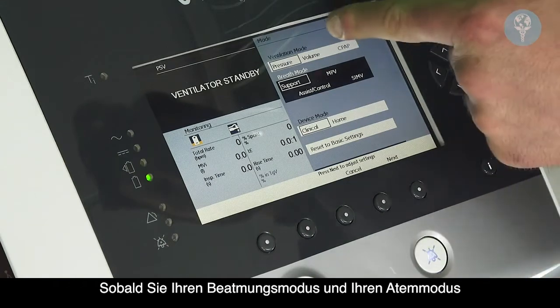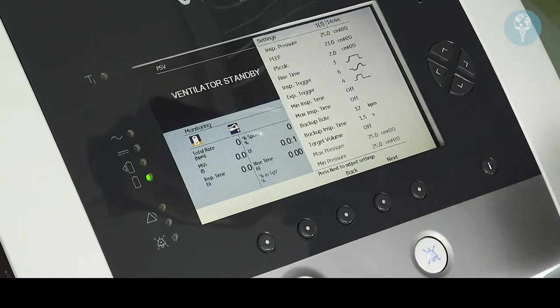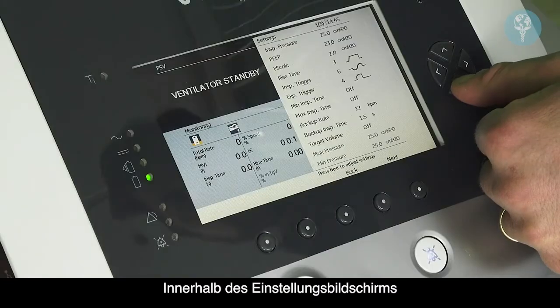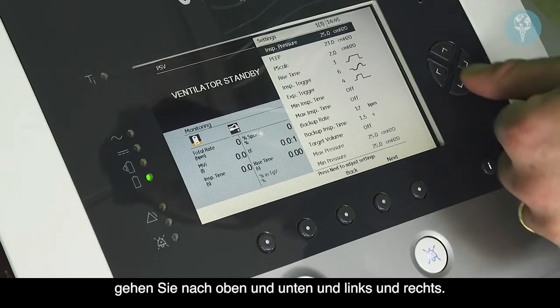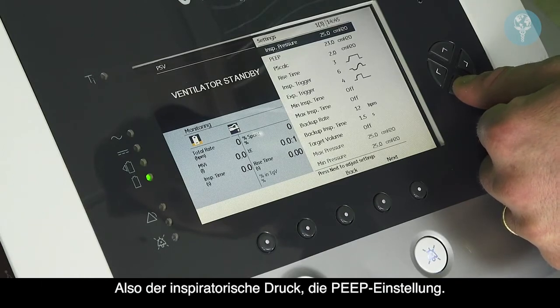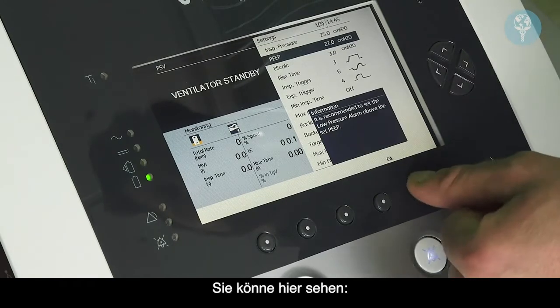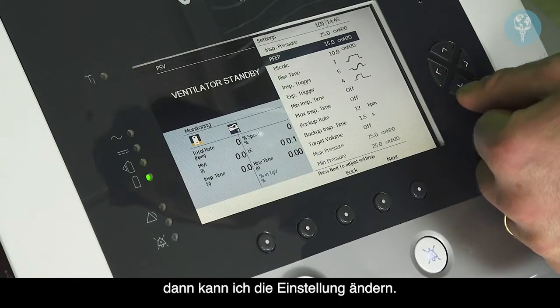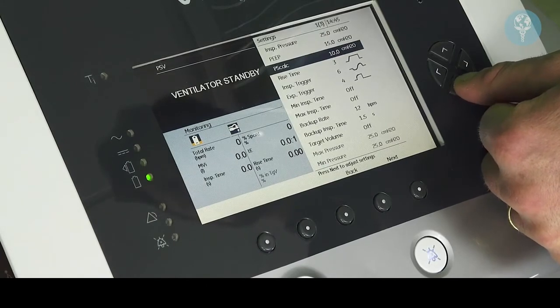So once you've selected your ventilation mode and your breath mode, we then select next. Okay, and from there we go through to the settings screen. So within the settings screen, you can set your patient parameters. So again, using your navigation buttons, your up and down and left and right, we can select the parameter we want to change. So the inspiratory pressure, the PEEP setting. So you'll see here, if I use my left and right buttons, I can change the setting, and then to confirm the setting, I simply just press down to move on to the next parameter.